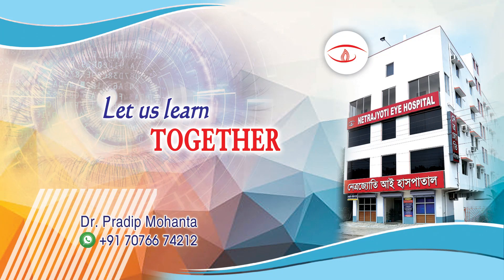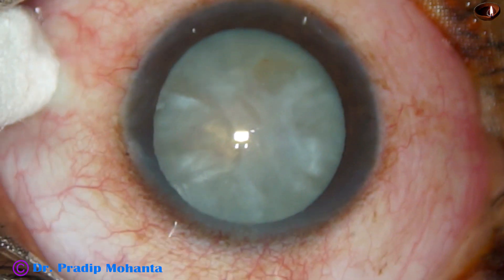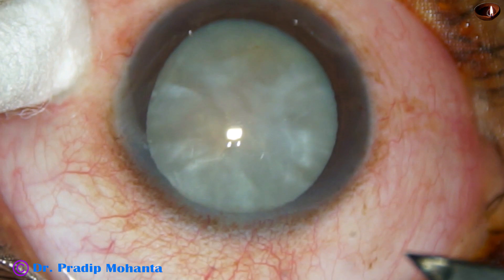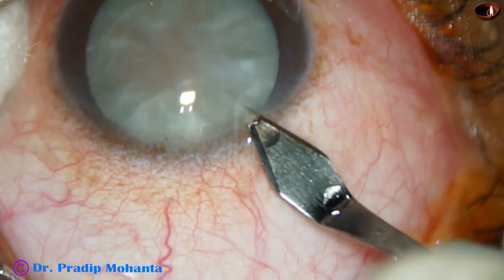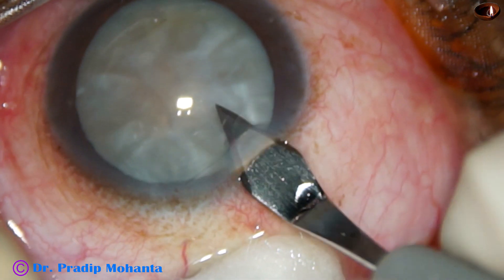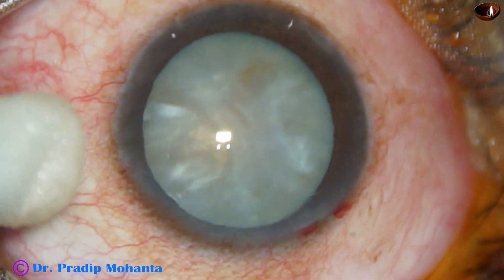Friends, welcome to my workplace at Ranaghat, West Bengal, India. This is an edited video of phacoemulsification of a cataract with anterior capsular fibrosis. You can see this is a mature white cataract and there is some whitish sheet just underneath the anterior capsule. Let us see how the surgery goes.